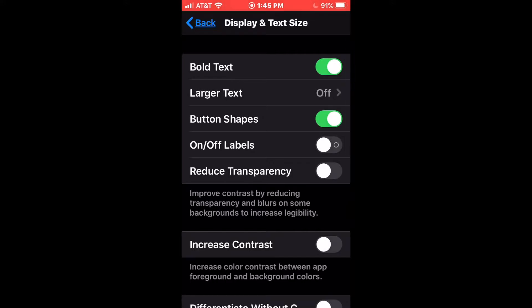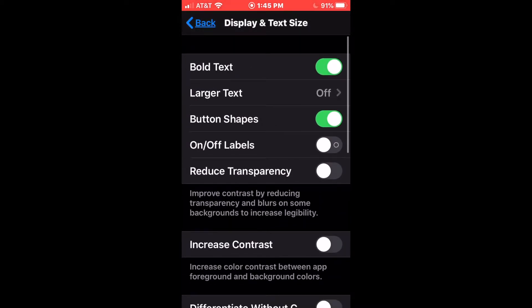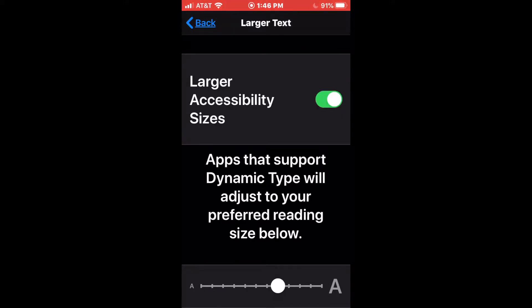Here we have a number of options which will affect things throughout our phone. For example, bold text will make the text on the phone bolder. Larger text, which is probably one of the ones we're going to be most interested in, is going to enlarge the size of the font on our phone. It will change the size of the text in the menus, but also change the size of text message text and things like that. Let's go ahead and turn it on. I'm going to turn on the larger accessibility sizes. That allows me to use a slider at the bottom to adjust the size of text. And we can see instantly that the size of the text in this menu has become much larger.